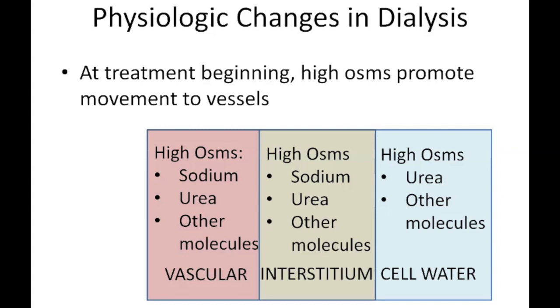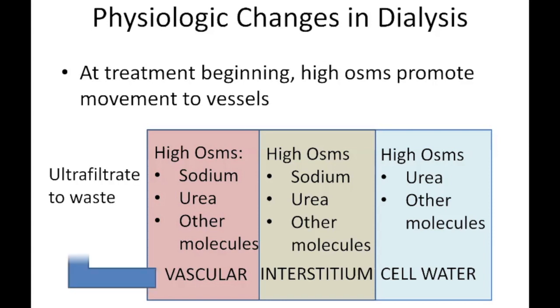Solutes move between the interstitial and vascular space. So as we change concentrations in the vascular space, everything will be cleaned equally in the interstitial space, basically simultaneously with the vascular space. But we don't have access to fluids that are in the cell water, and so we'll see how that can have an impact. As we begin the dialysis session, not only are we doing cleaning, but we're doing fluid removal, as we showed in that first diagram of convective clearance or ultrafiltration. So this ultrafiltration will effectively remove water from the patient, and that fluid is thrown out.